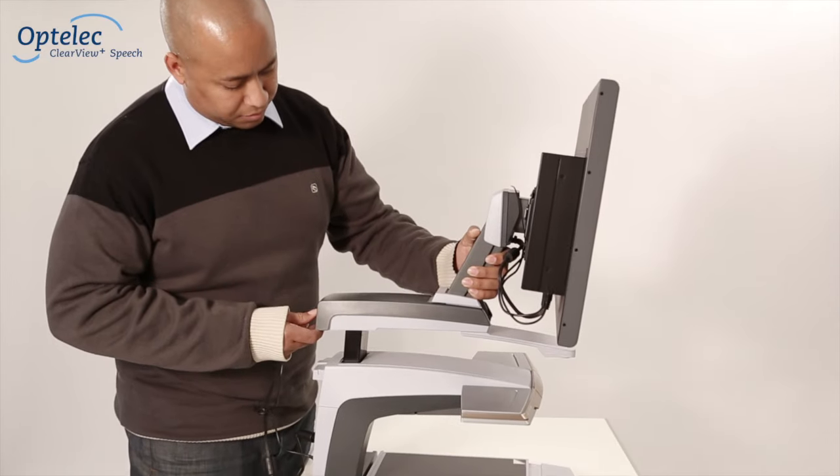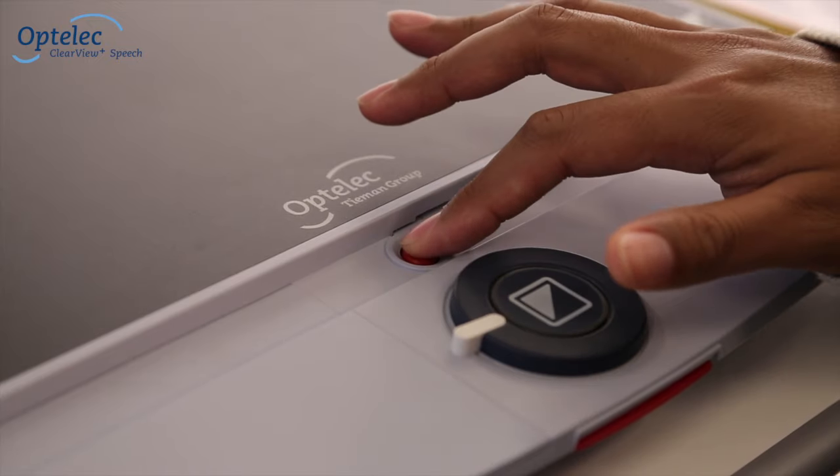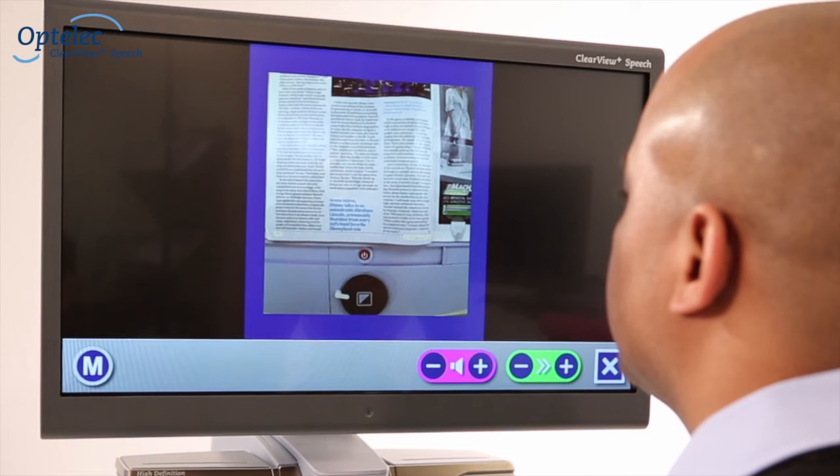Attach the module to a Clearview Plus desktop video magnifier. Turn the Clearview Plus on. Tap the screen to activate the speech function.